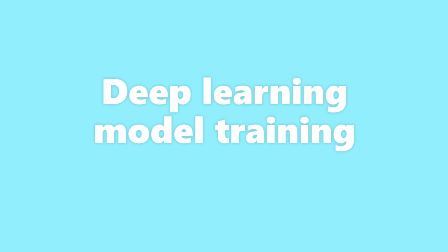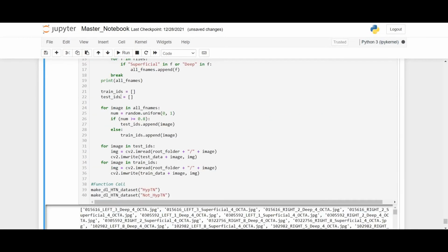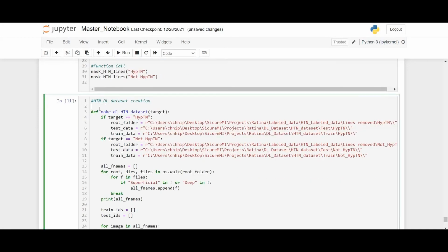Now let's train our deep learning model. To train the deep learning model we will again go to the master notebook and run the code of deep learning dataset creation. This code will remove the red and green lines from the images and split the data set into training and testing images. This process will take about 1 to 1.30 hours to complete.